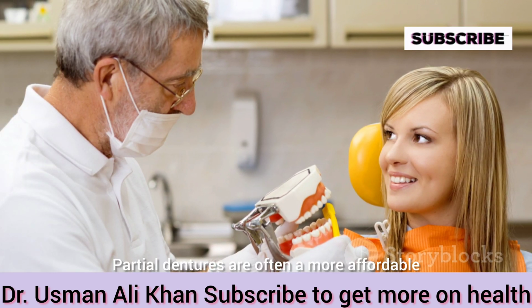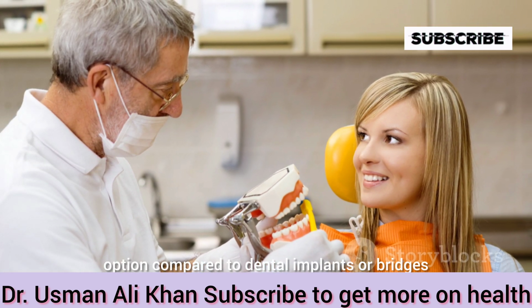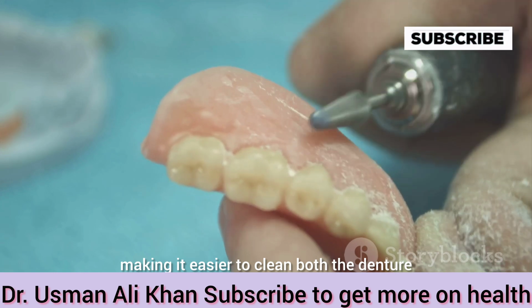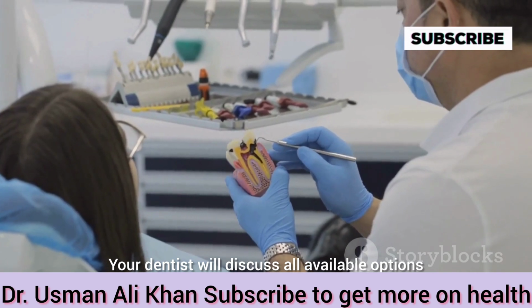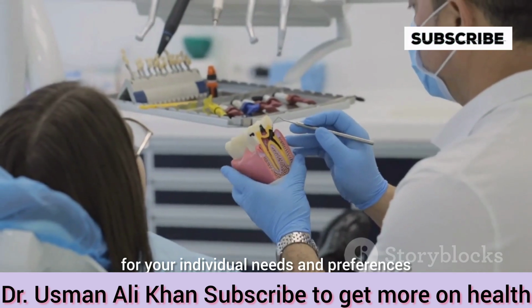Partial dentures are often a more affordable option compared to dental implants or bridges, especially if you're missing multiple teeth. They are also removable, making it easier to clean both the denture and your natural teeth. Your dentist will discuss all available options with you to help you make the best choice for your individual needs and preferences.